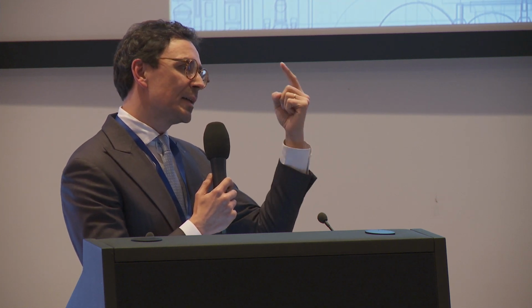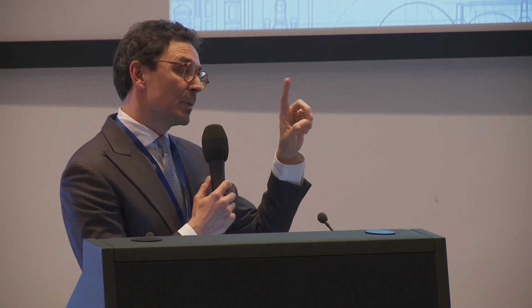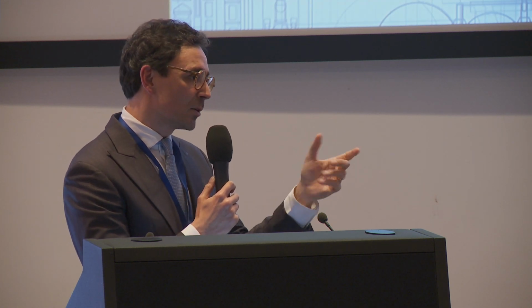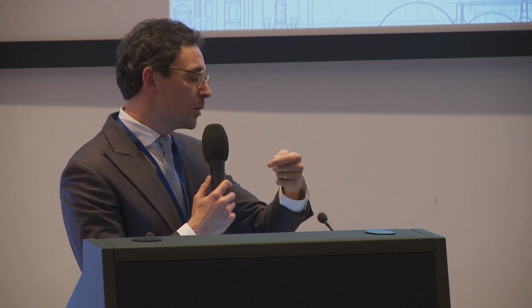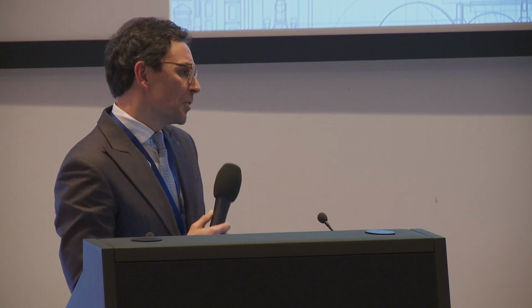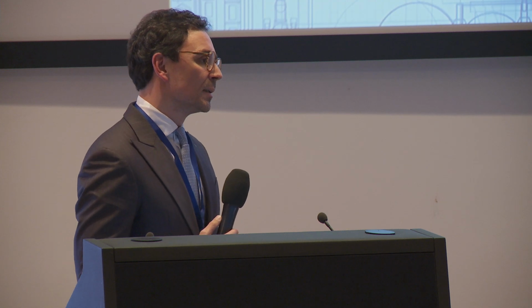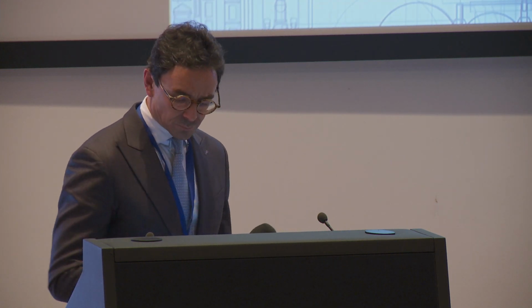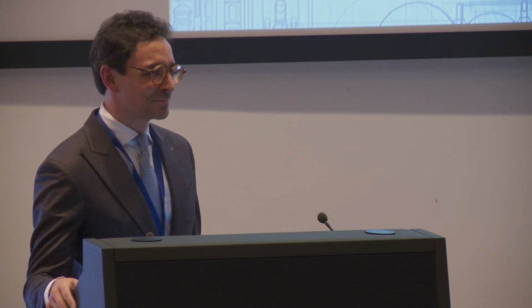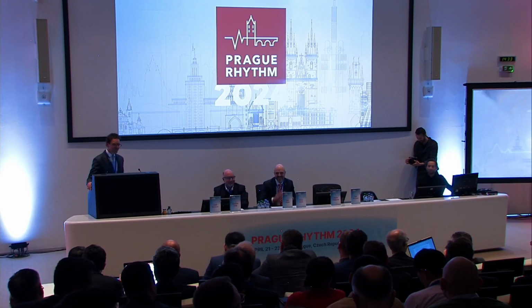We start ablating on the right side. Because if you ablate on the right side, you excite the ganglion long enough, and you will never have pauses, because pauses only occur on the left side. And then there's always the issue about volumetric lesion, because now for a lot of technologies it's a volumetric lesion, not a targeted lesion. Okay, fine. I think I'm finished. Okay, thanks. Thank you.